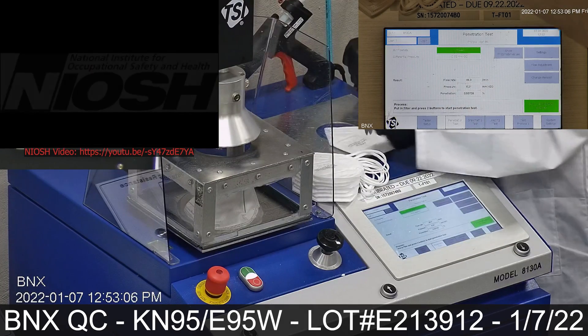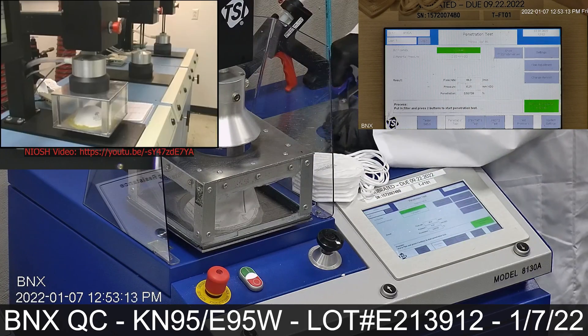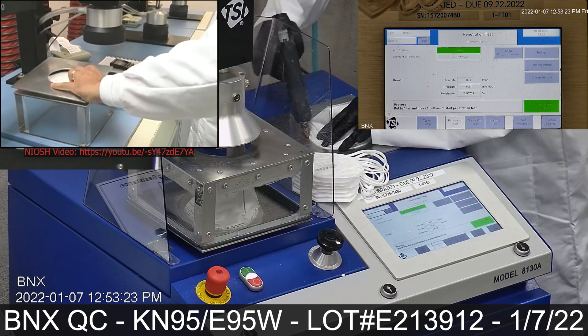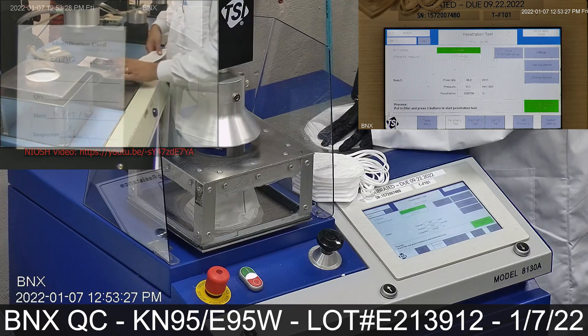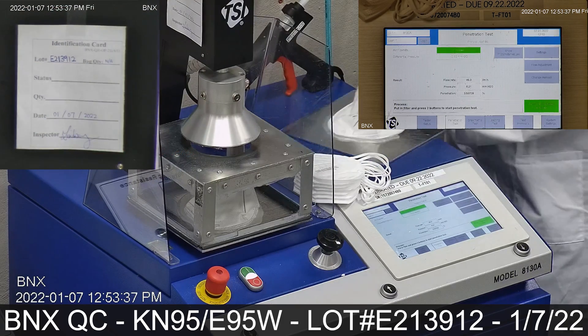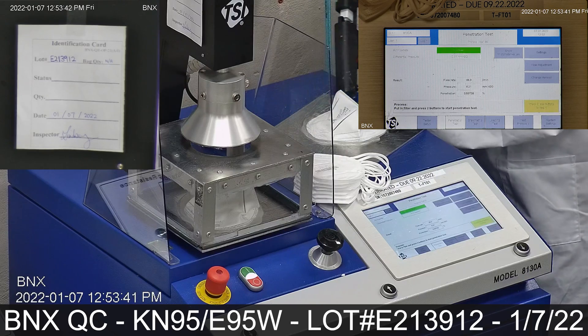Our testing method is inspired by NIOSH. A testing box with frame and plate were manufactured for the purpose of testing complete masks and respirators in our facility as part of our standard quality control procedure.